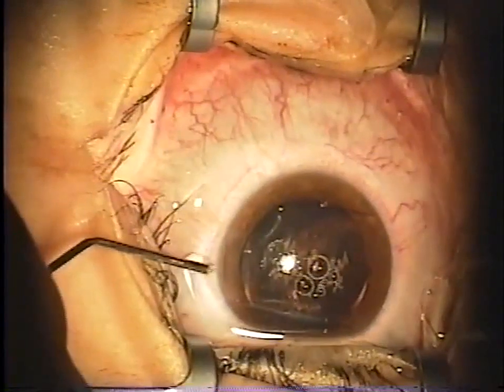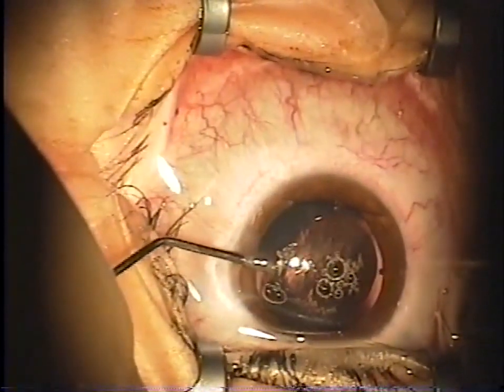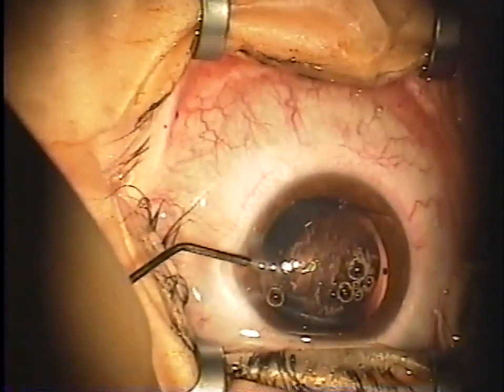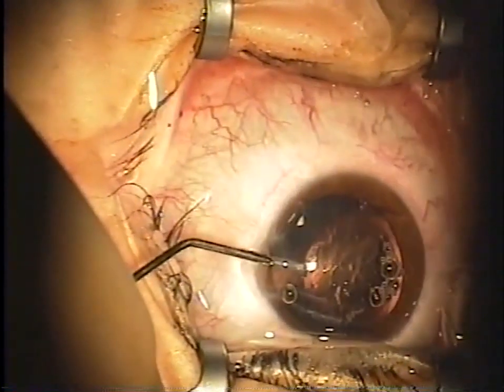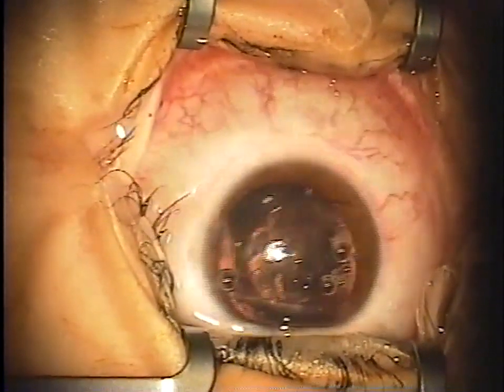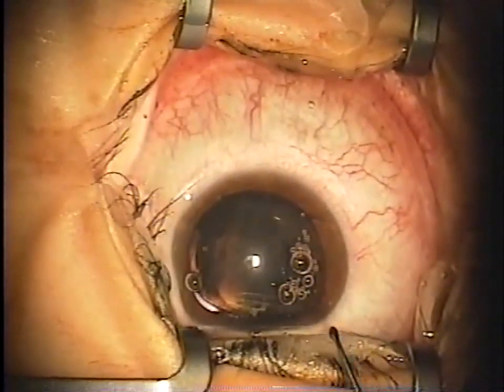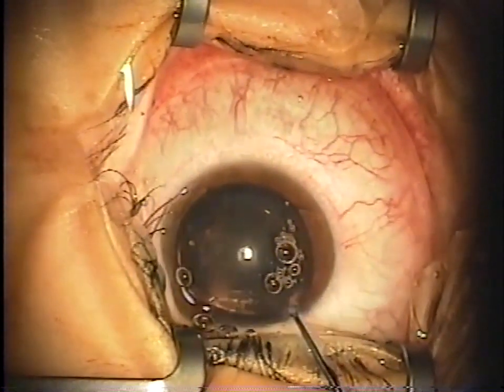Next, a little bit more OcuCoat on the surface of the ICL to help push it down away from the endothelium. Again, in this procedure, since the patient is phakic, you want to be very careful of the lens, and you also want to be very careful of not damaging the endothelium, as these are generally very young patients who are going to need their corneas for a long time.